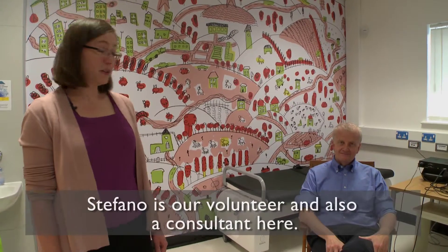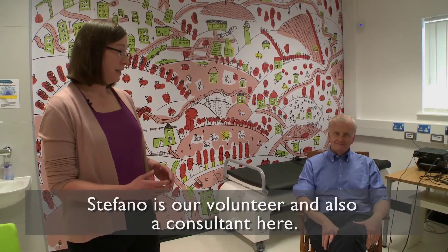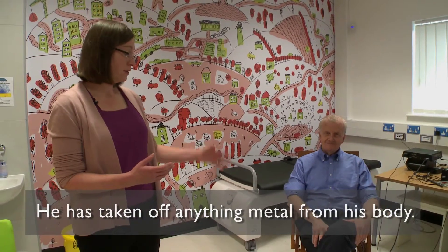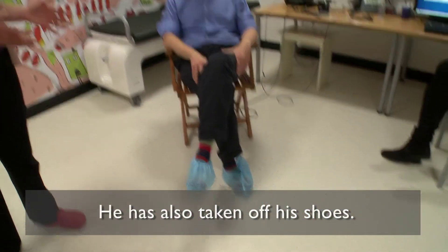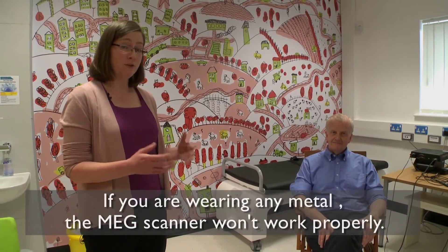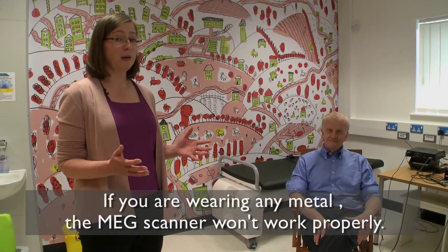Stefano is going to be our volunteer today, and the first thing we'll notice is that he has taken off anything that was on his body that might contain metal. He's not wearing his watch, he's not wearing his belt, he's not wearing his glasses, and he's also taken his shoes off because your shoes can contain small bits of metal as well. This is really important because if you're wearing any metal when you go into the MEG system it won't work properly.